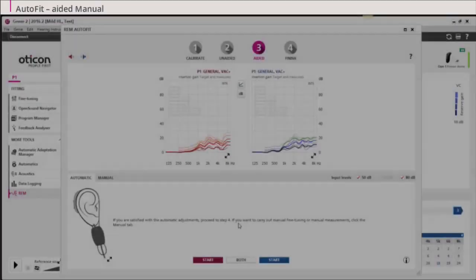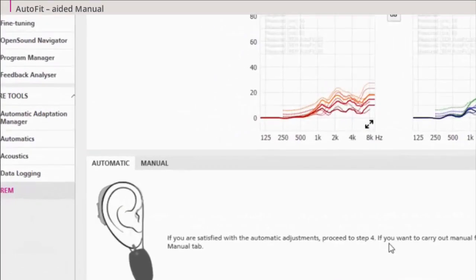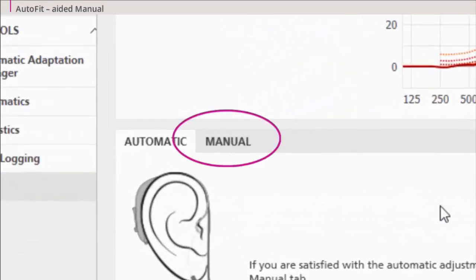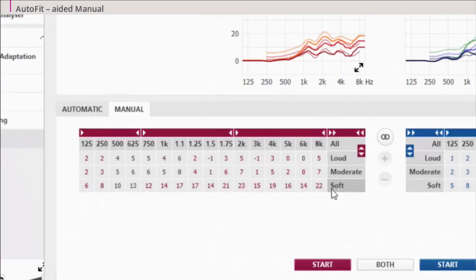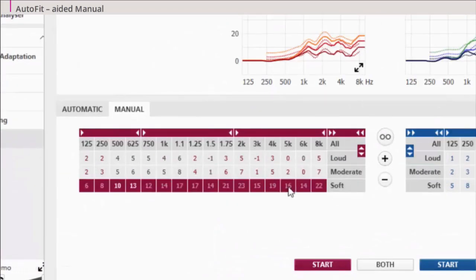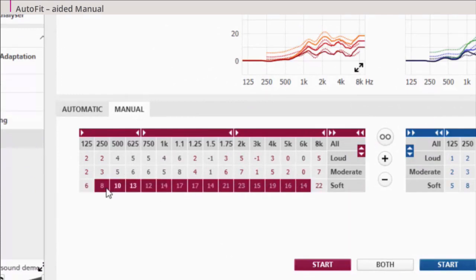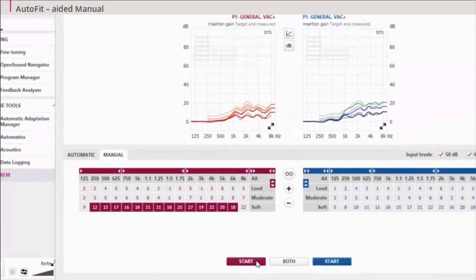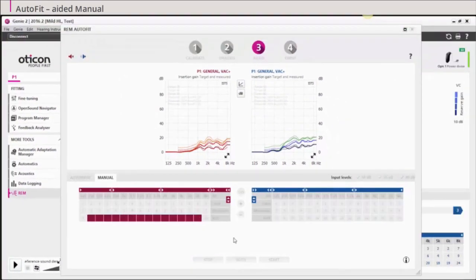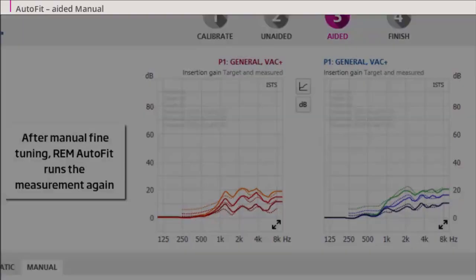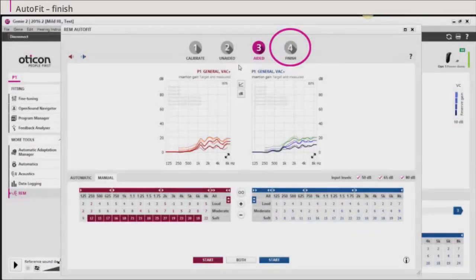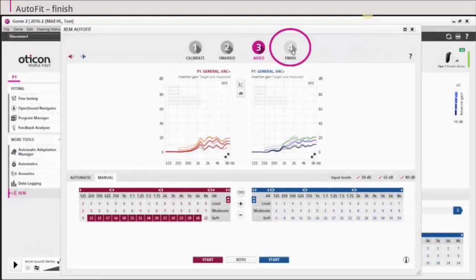For fine tuning and further adjustments of the gain, you can choose the manual option. After manual fine tuning, REM AutoFit runs the measurement again to verify the fitting. Select finish to conclude the measurement.